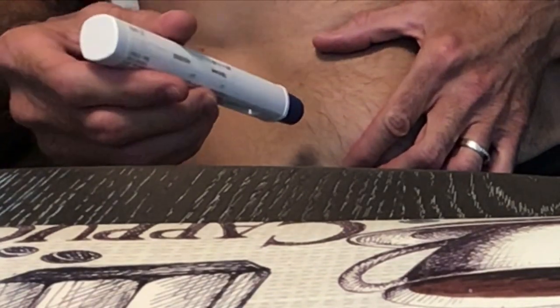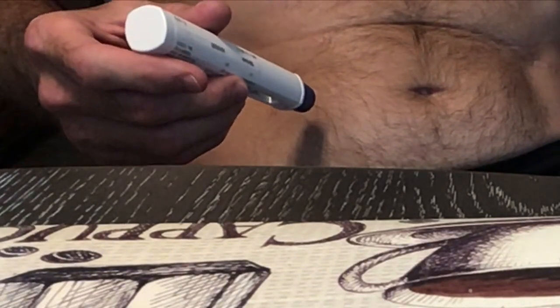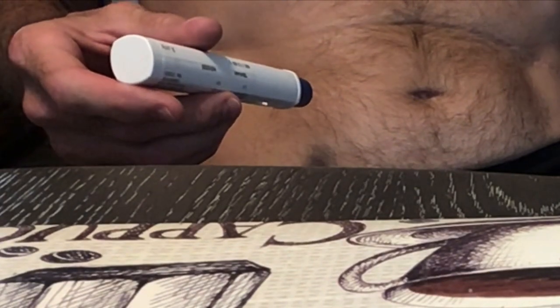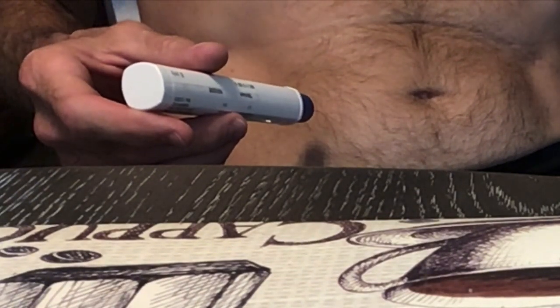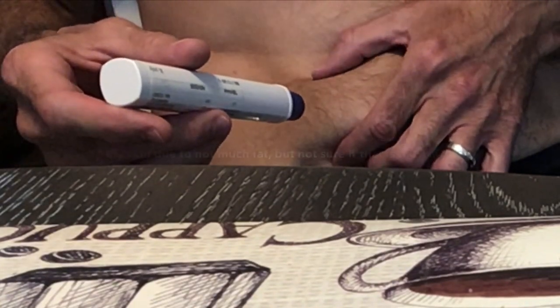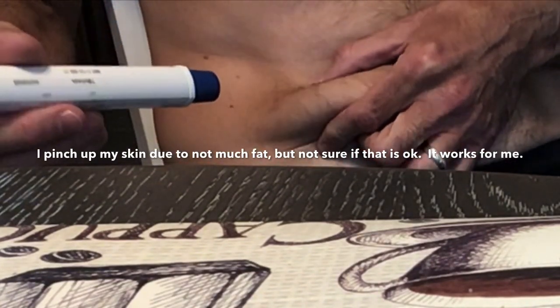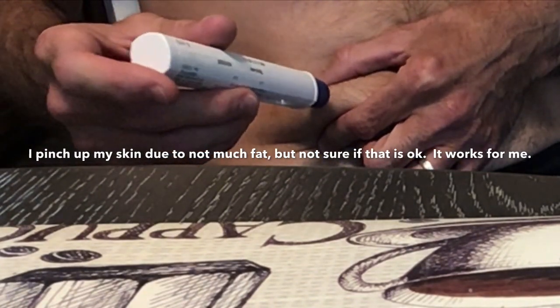You could also use an ice cube to numb up the area, which I didn't do — I forgot about that. So what I'm gonna do is go ahead and give myself this injection and pinch it up like this. It worked last time, so that's what I'm gonna do.